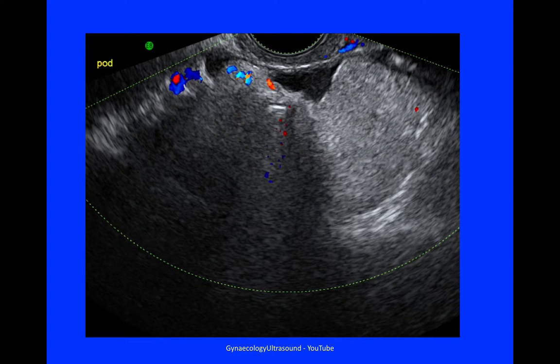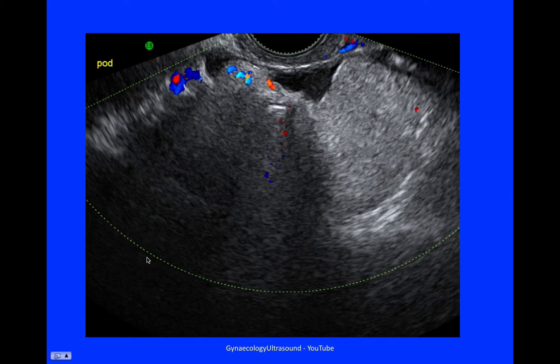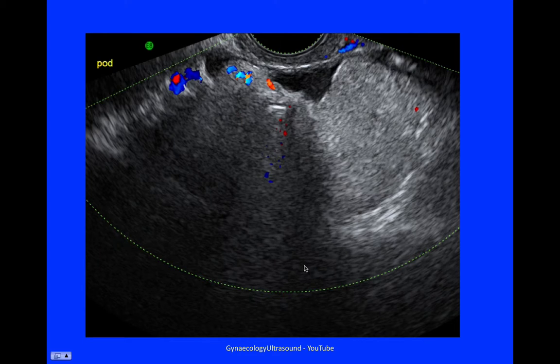This lesion measured 80mm. It was unilocular — here is the extent of the lesion, and you can see it's quite difficult to see the edges in this single view. There was mixed echogenicity, shadowing, and minor vascularity.